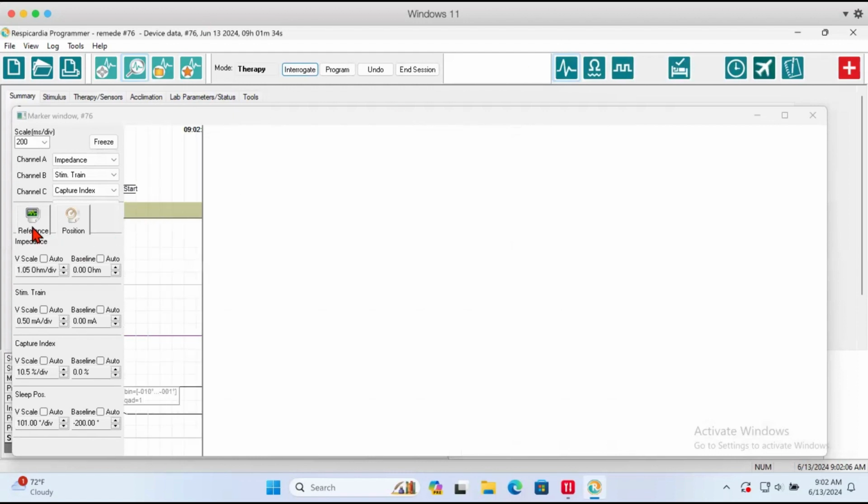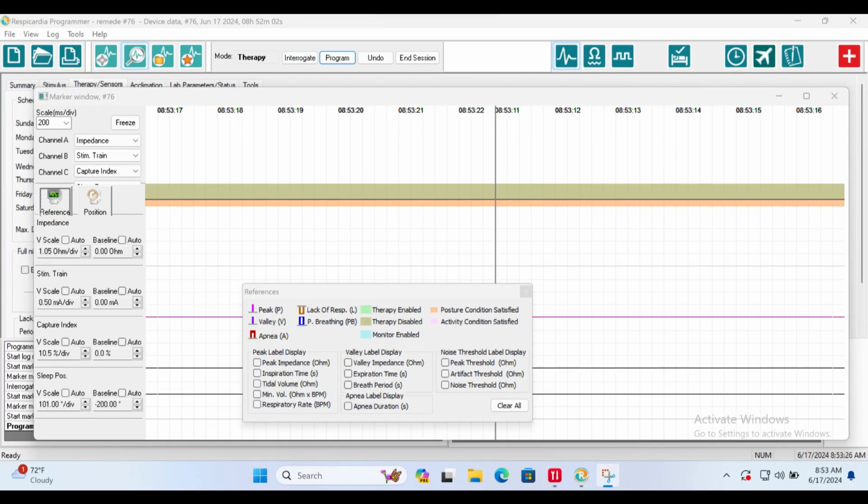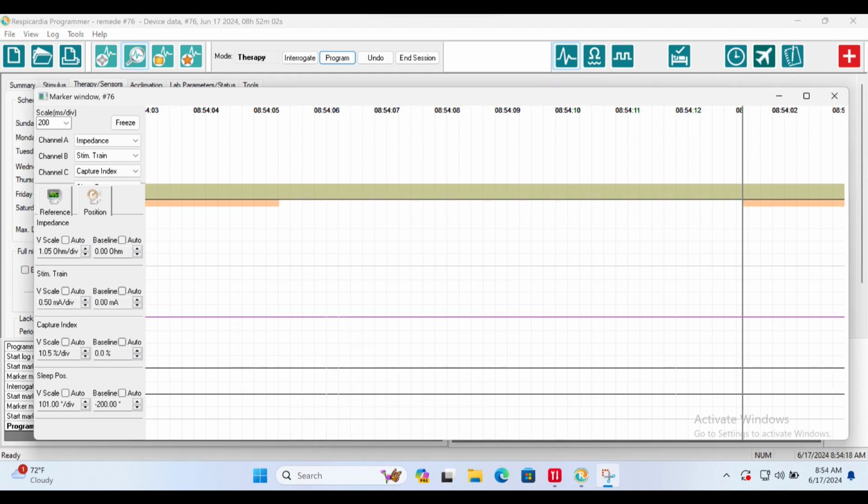An orange line represents posture condition satisfied. Ask the patient to lie down in their sleeping position and ensure the orange line is visible. As the patient sits up beyond the pitch threshold, the orange line will disappear, indicating a pitch violation.